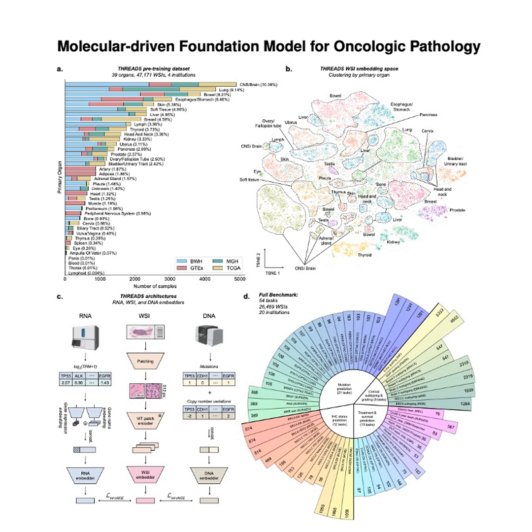What else? Third, IHC status prediction. 12 tasks. Predicting the expression levels of important proteins like PD-L1 or HER2, usually measured by immunohistochemistry. Again, vital for treatment decisions. And finally, what many consider the holy grail, treatment response and survival prediction. 13 tasks in this group, predicting how patients will fare or if they'll respond to specific therapies. And this last group often involves the smallest, most difficult to work with patient cohorts. The exact area where data scarcity bites hardest.